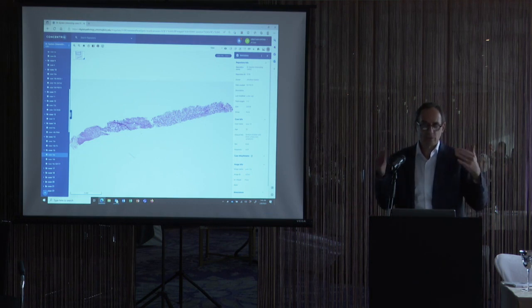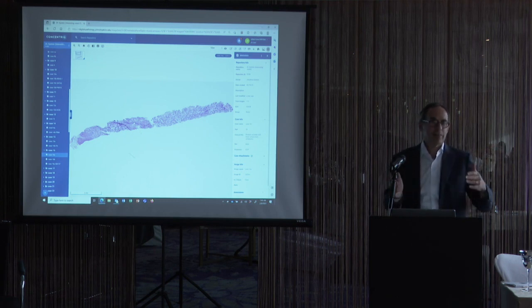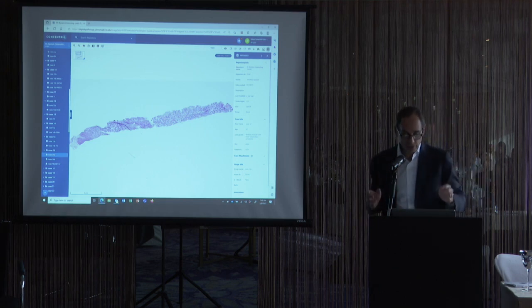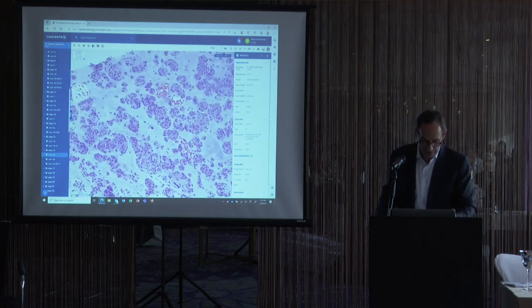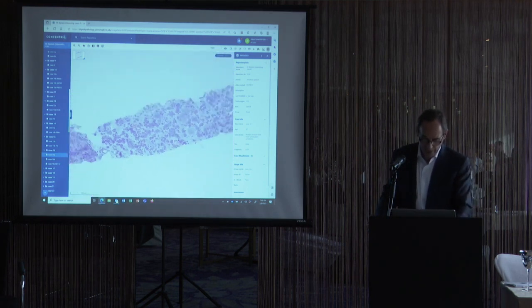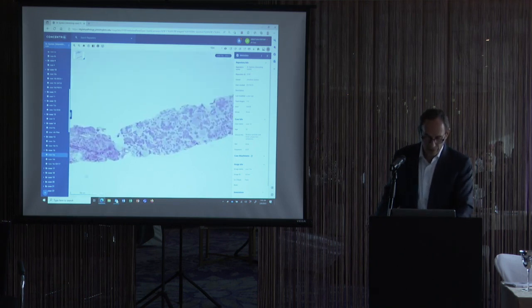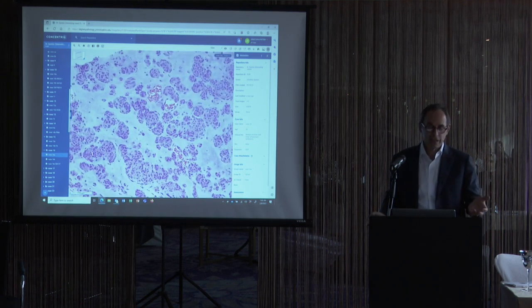If something's labeled prostate biopsy, we think, okay, what in the prostate could this be? We're not thinking maybe it's not even in the prostate. Maybe it's a periprostatic lesion. So when you see something that doesn't look like any normal prostate tissue, it looks kind of mesenchymal, and you step back and say, I don't see any prostate lesion, you have to ask again, could this be a soft tissue tumor arising outside the prostate, either pressing the prostate or adjacent to the prostate?